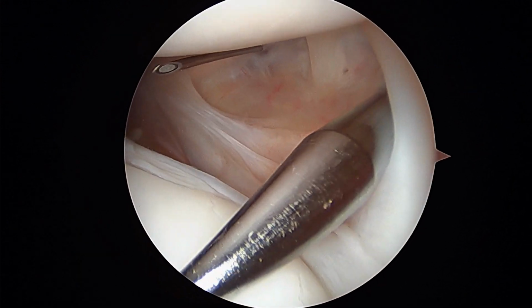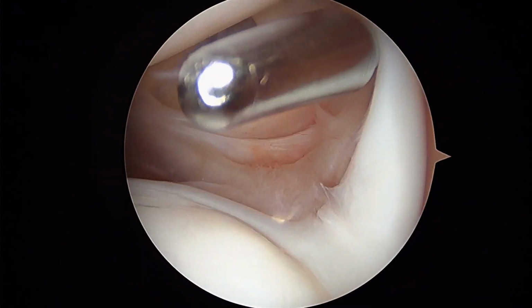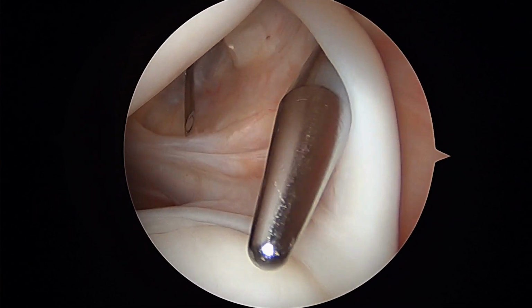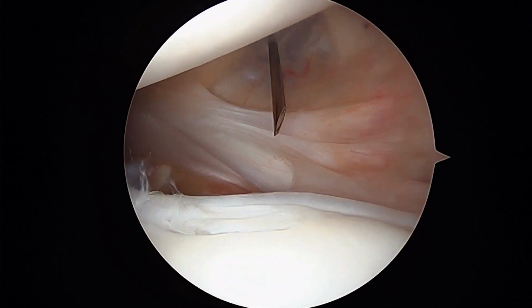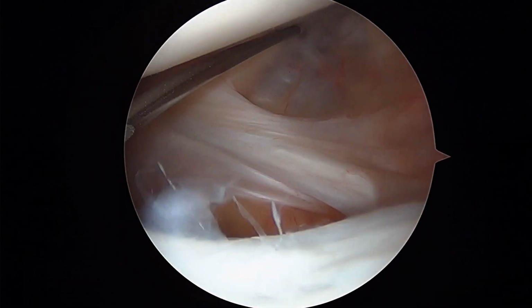So your arm is up in the air, you're laying on your side, and this is what we do to get our cannulas in position. This switching stick is already coming in the rotator interval just behind the biceps tendon, and this other cannula here is a really important position where the second cannula is going to go.